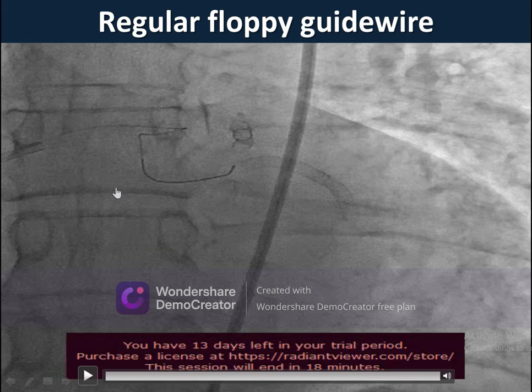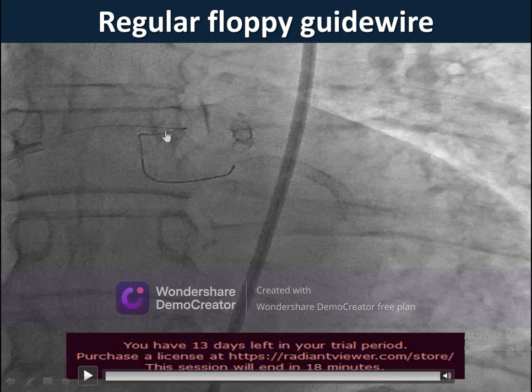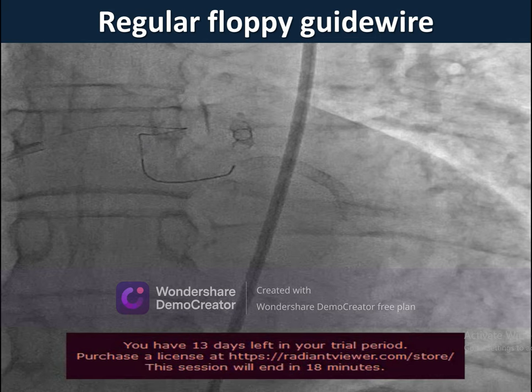As we all know from the physics of wiring, when you have a lot of bends, especially bends of about 90 degree angles with different bends in the 3D construction, this will lose all of your pushability of the wire.